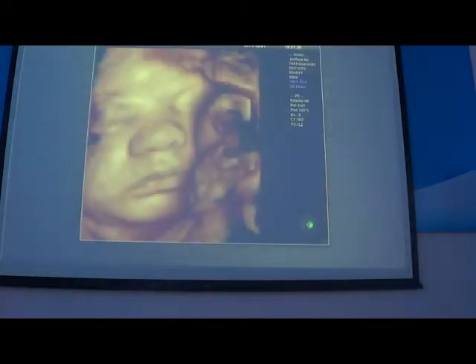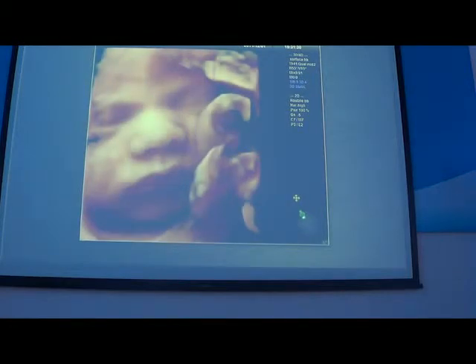And this is a new mode. You have it on the high-end system. The name of this mode is the HD light. With this we can move the position of the light.